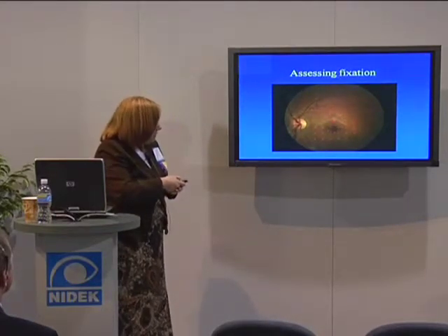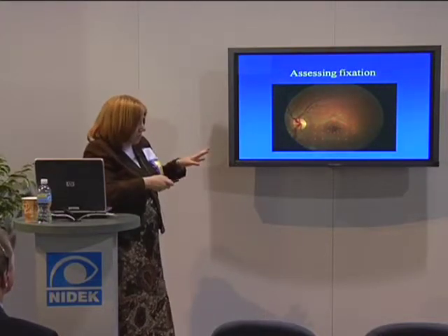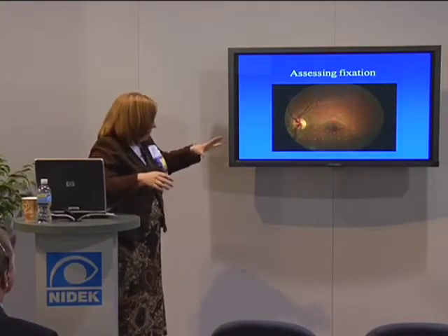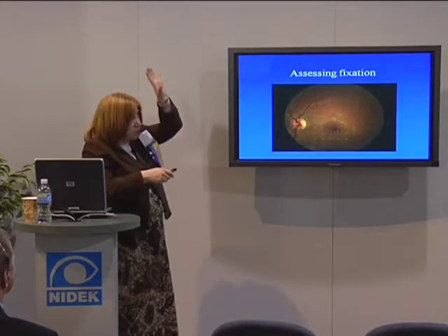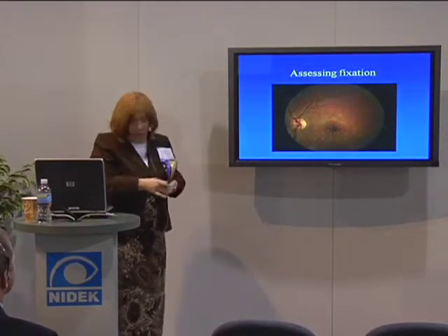So this person on the retina is placing the cross above the scotoma. That means in visual field space, the scotoma is up here, and they're looking up in order to move the scotoma out of the way to see.